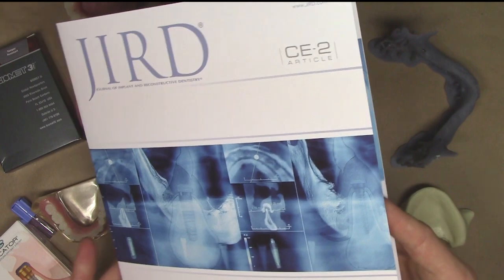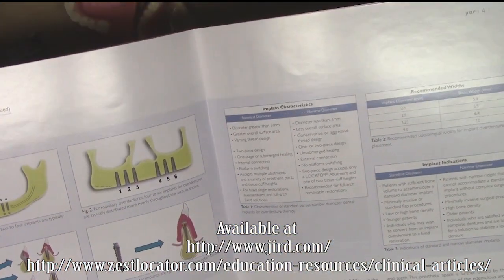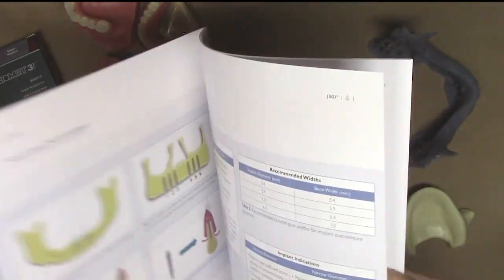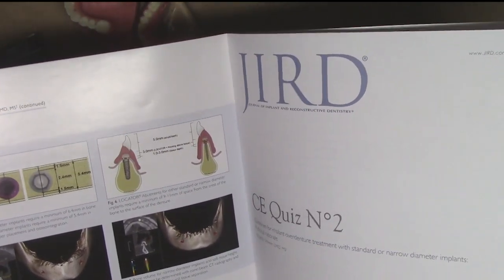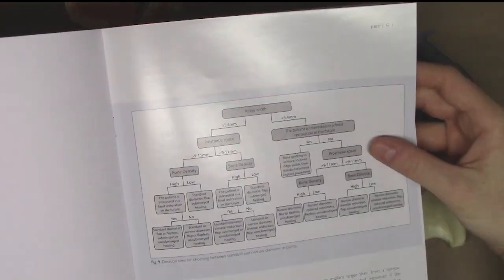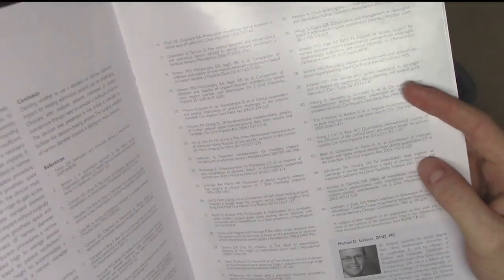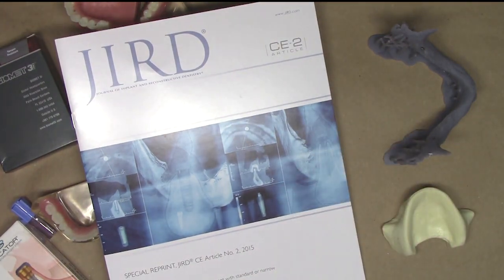I'm going to go ahead and go through most of the features of this article, and this article is available from either Biomet 3i as well as Zest Anchors, or on the Journal of Implant and Reconstructive Dentistry website. Inside of this article is a comprehensive review as well as a prospective type analysis of when clinicians should be making decisions about when to place a standard diameter implant or a narrow diameter implant for the purposes of an overdenture. So I also have in front of you a multitude of different information as well as models to describe some of the features and things that I have talked about in this article.